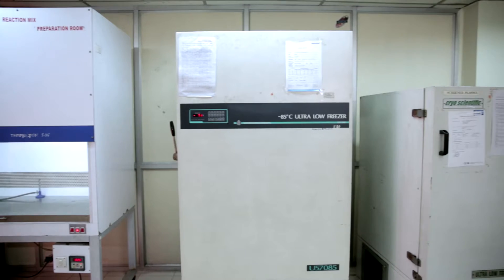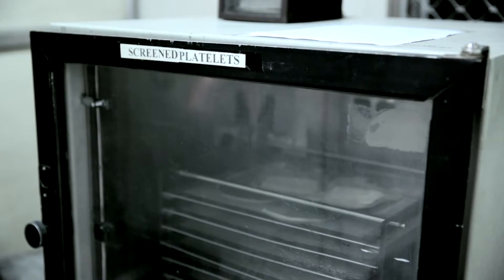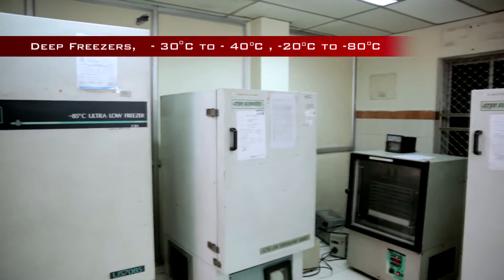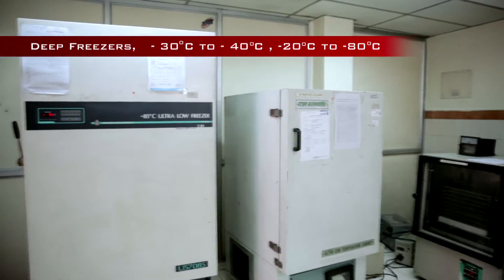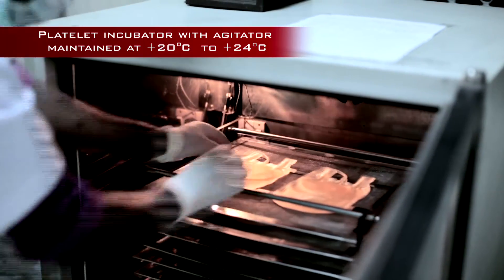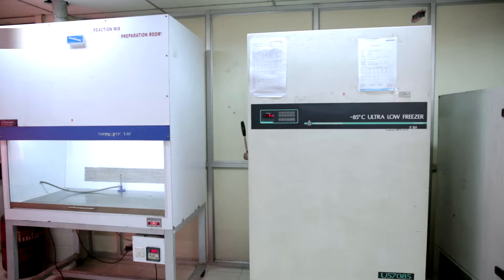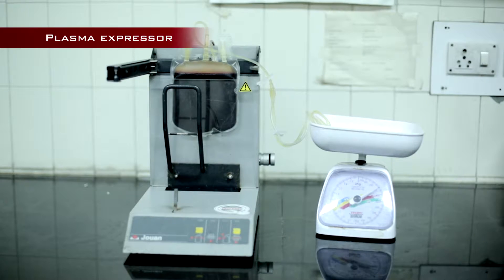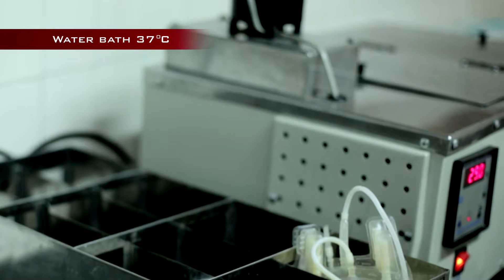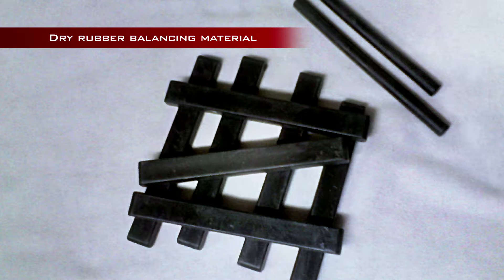Ambient temperature of the room should be maintained between 20 and 25 degrees centigrade. We need the following equipment to prepare and store blood components: deep freezers (-30 to -40°C or -20 to -80°C), blood bank refrigerator (2 to 6 degrees centigrade), platelet incubator with agitator maintained at +20 to +24 degrees centigrade, refrigerated centrifuge, laminar airflow, weighing scale, plasma expressor, dielectric sealer, stripper, water bath at 37 degrees centigrade, cryoprecipitate bath at 4 degrees centigrade, and dry rubber balancing material.